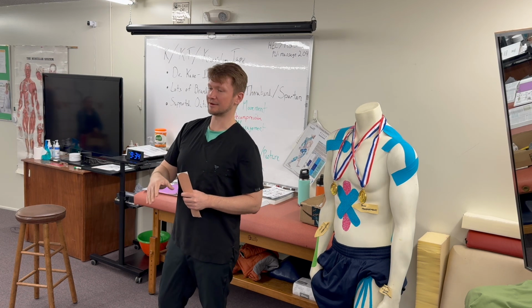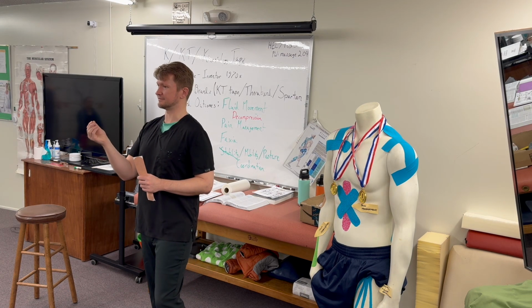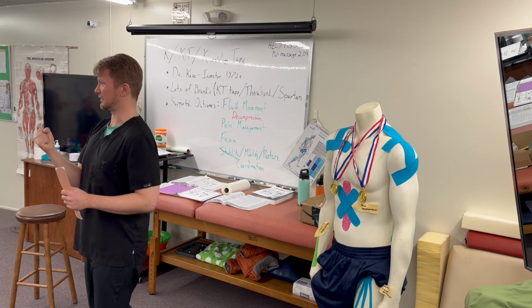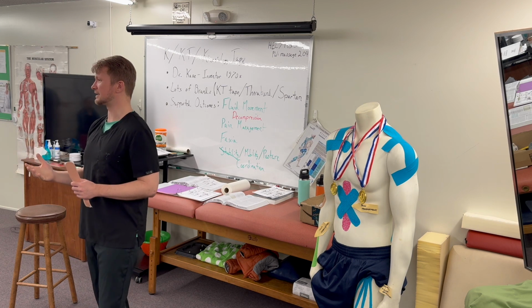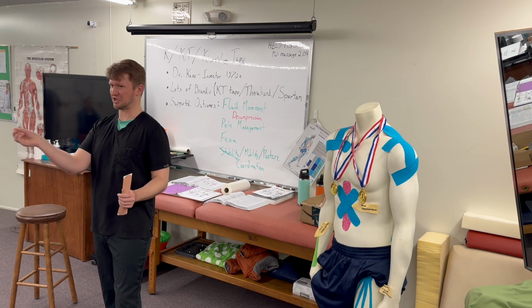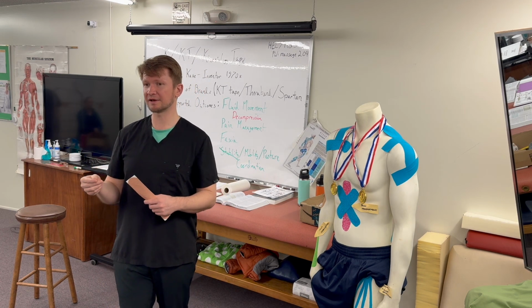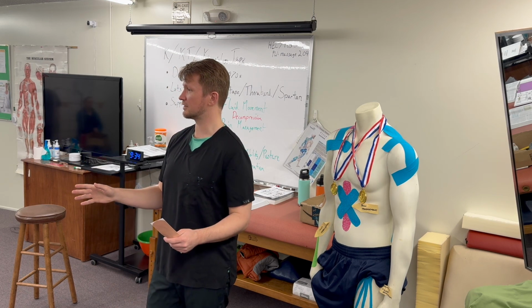The thing that I really preach caution about is that its adhesive is aggressive. So you have to be really careful with sensitive or thin skin, as it will take skin with it. Any of these where the adhesive is really aggressive, you just have to be cautious with that.